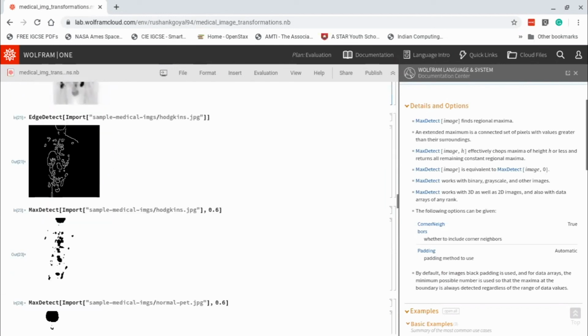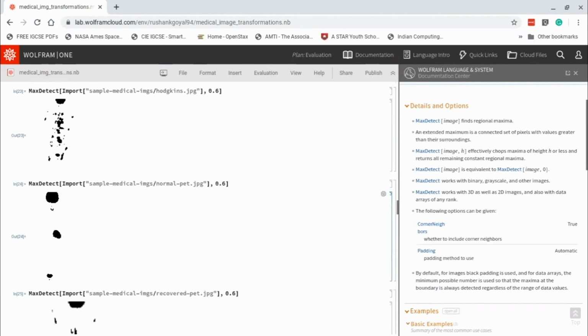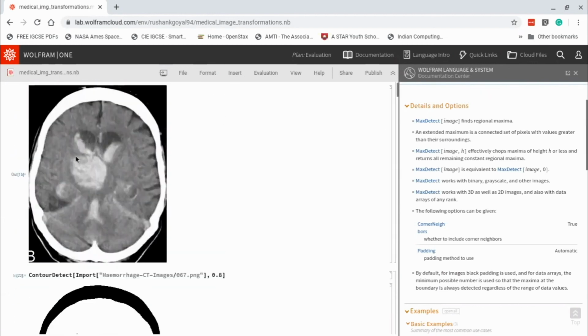Nice. So you're making a machine learning diagnosis tool. Yeah, I think I only told this to you; the other people might not be familiar. I'm making a tool concerning hemorrhage. That's why I had these images of hemorrhages, normal and hemorrhage.